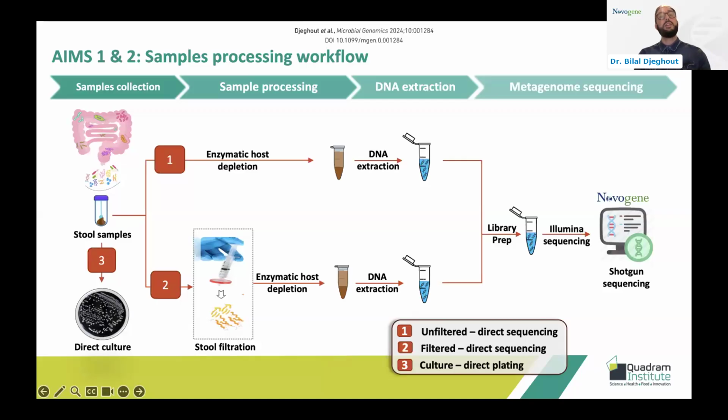Third, conventional culture was employed by direct plating of stool samples, yielding isolated Campylobacter colonies. These cultured isolates served as crucial references for benchmarking and validating the metagenome-derived genomes, or MDGs, generated by shotgun sequencing. Altogether, these workflows enabled robust comparison between direct metagenomics and culture-based methods, laying the foundation for our rigorous evaluation of Campylobacter strain detection in clinical settings.